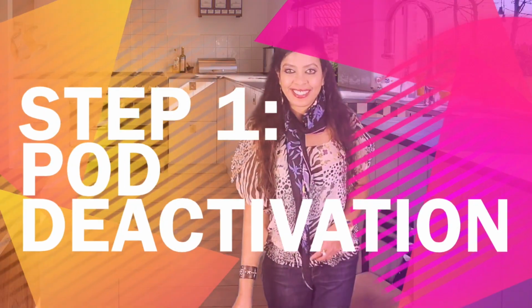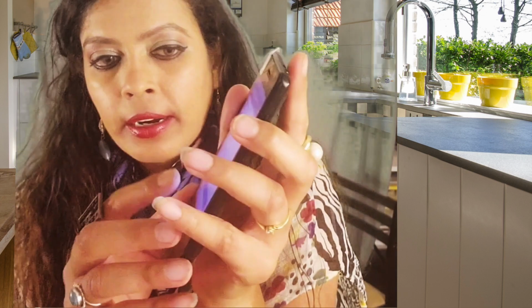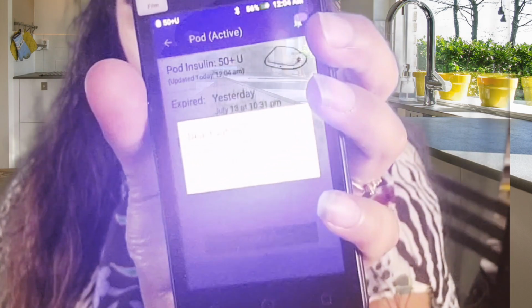Well, first things first, deactivate the pod. So this is my PDM. I just go to the pod details here and hit change pod. When I do that, I will automatically get an option to deactivate my previous pod. So that's what I'm doing. Now my pod is deactivated.